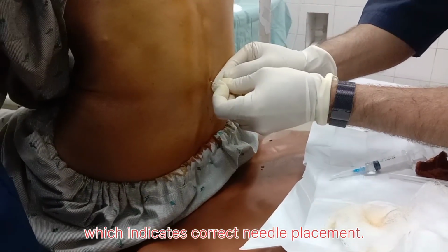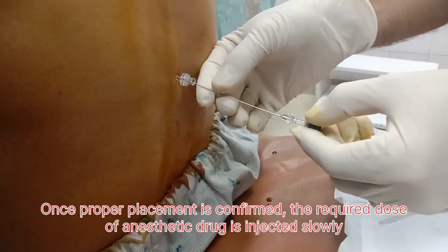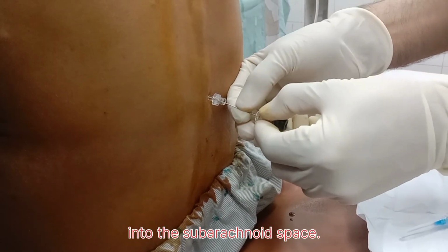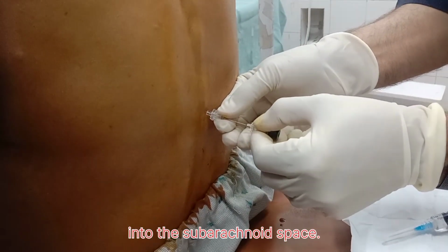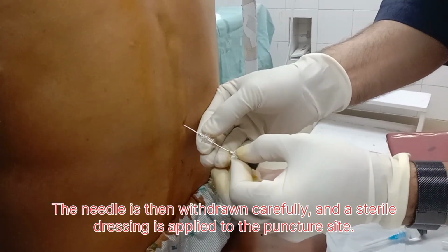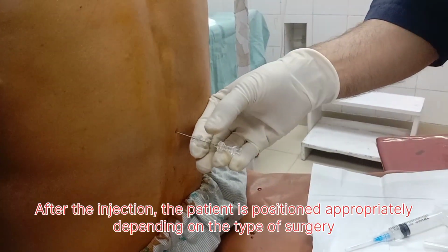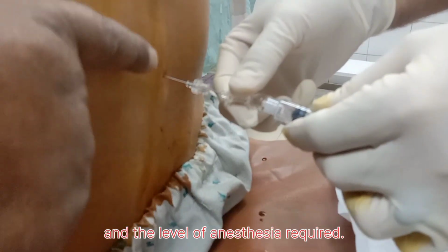After the injection, the patient is positioned appropriately depending on the type of surgery and the level of anesthesia required. Continuous monitoring of vital signs, including blood pressure, heart rate, and oxygen saturation, is essential throughout the procedure. Within a few minutes, the patient begins to experience numbness and loss of sensation in the lower part of the body. The level of block is assessed before proceeding with surgery to ensure adequate anesthesia.